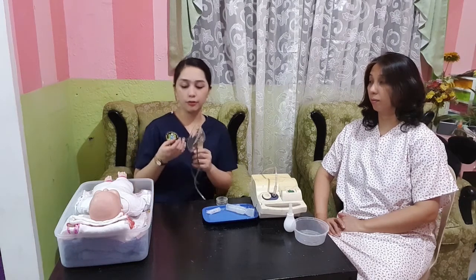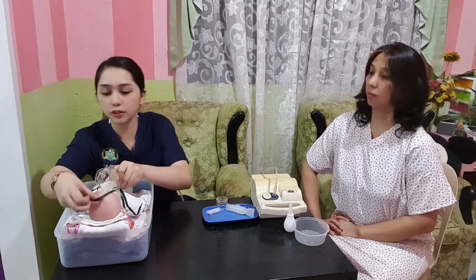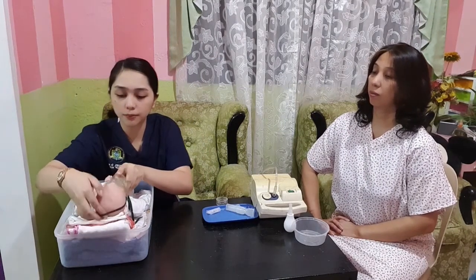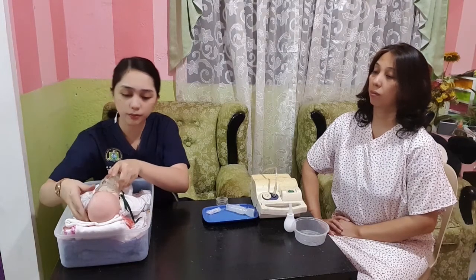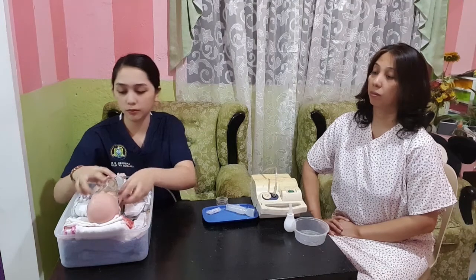Thank you, ma'am. So if the patient is unable to hold the mouthpiece, I will replace the mouthpiece with a mask, and I will put it on the baby. So use of face mask does not require the patient to remember to hold the mouthpiece correctly. So correct delivery ensures sufficient deposition of medication.